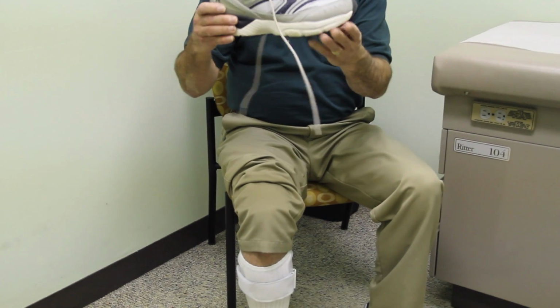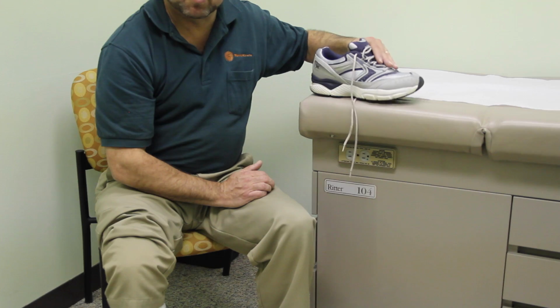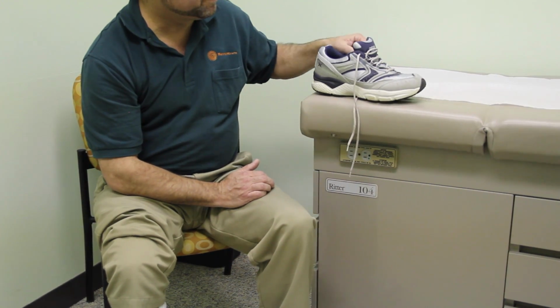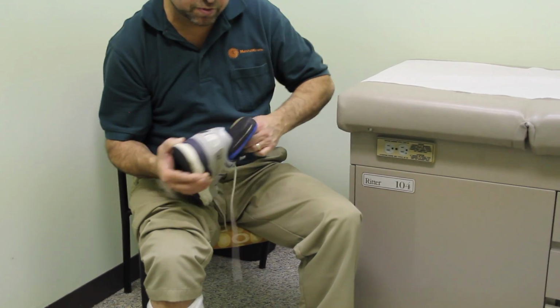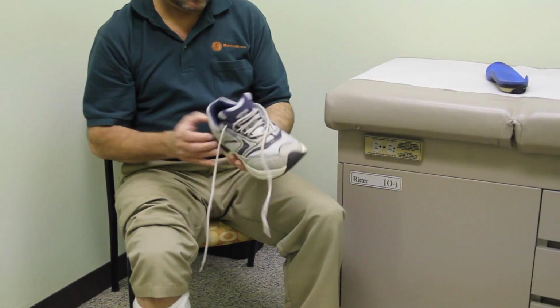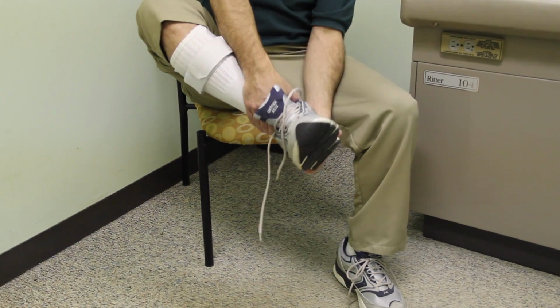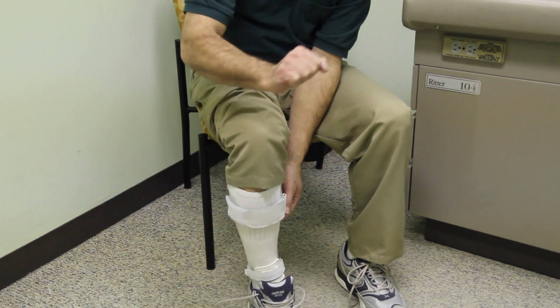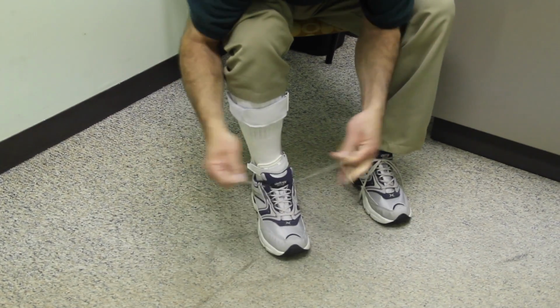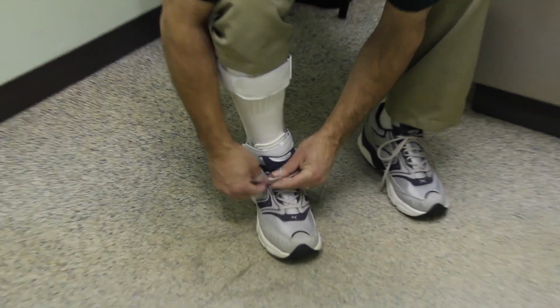It's real important that the shoe that we use with the AFO brace has a rocker sole to it. The rocker sole means that the sole rolls up. The rollover will allow you to walk more smoothly without impingement. So we'll remove everything that's in the shoe to fit the brace into. Work it in, adjust the back so it's not pushing you forward. Then we lace up the shoe and have the patient ambulate.